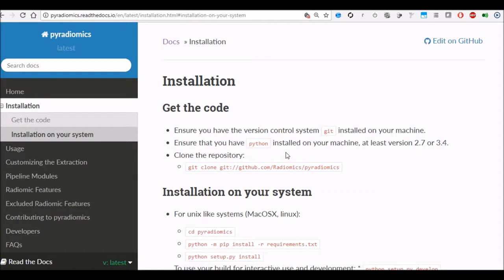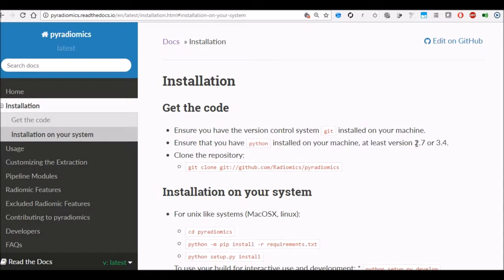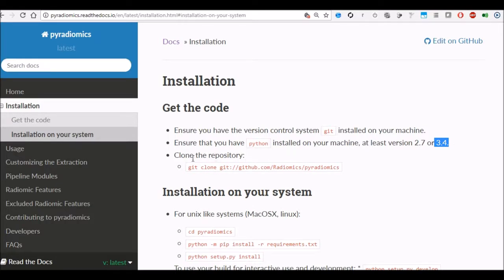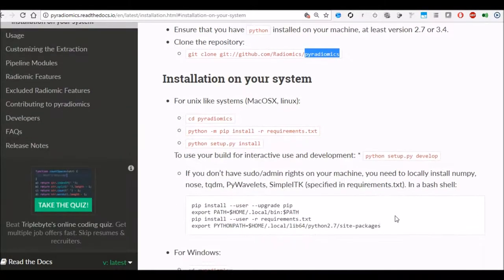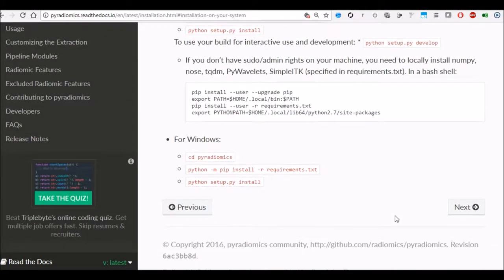And then you need to have Python which can be either 2.7 or 3.7. Any other versions may not work smoothly on your machine. I installed 3.4 and tried to work with it but I ran into some problems. Once you install the Python then you can use git to clone the repository into your machine and it will create a PyRadiomics directory wherever you specify the path.